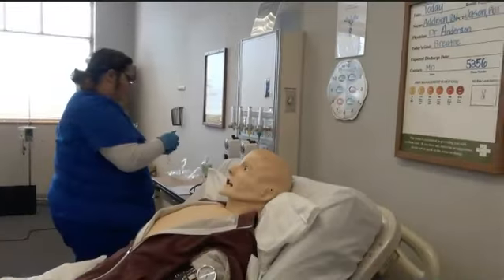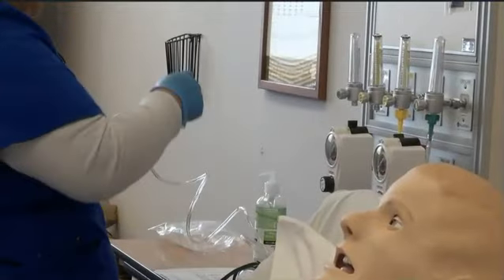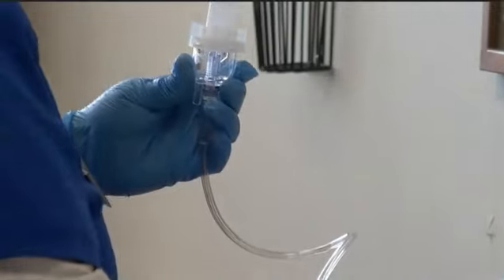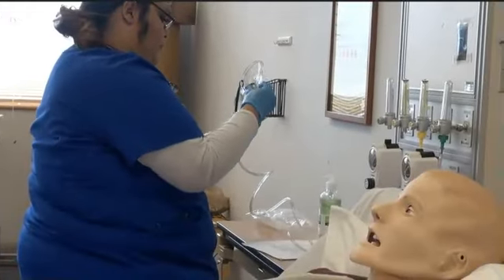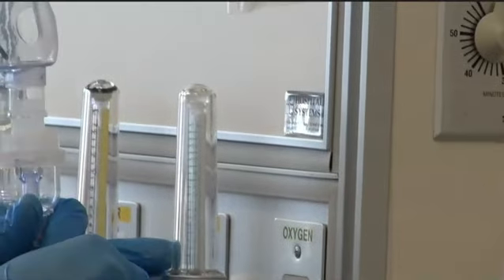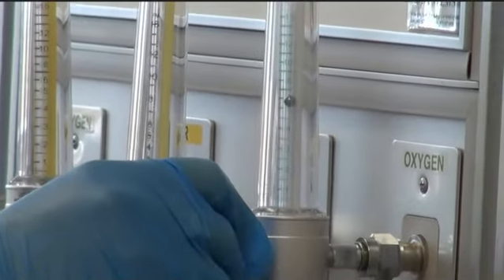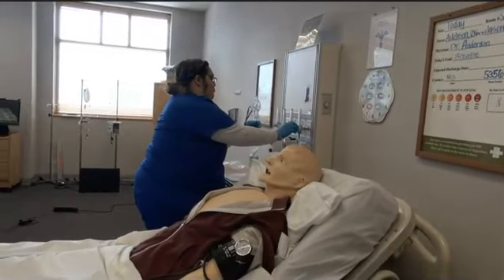Next, she will get her medication and accurately prepare the prescribed dosage and inject it into the nebulizer. In this scenario, she is attaching a mask, but normally you would attach a mouthpiece. She turns on the flow to the flow meter that meets the manufacturer's flow rate, which may be between 6 and 10 liters. Watch how she communicates with the patient.